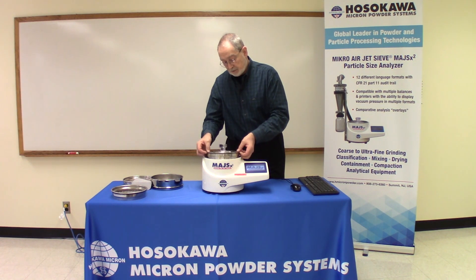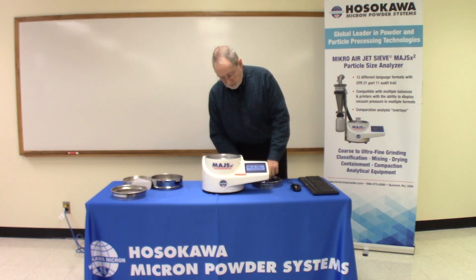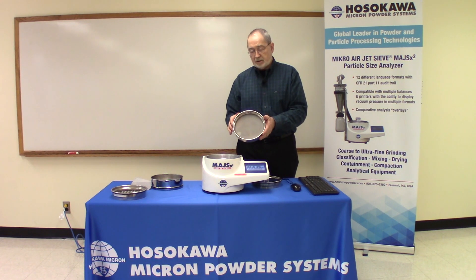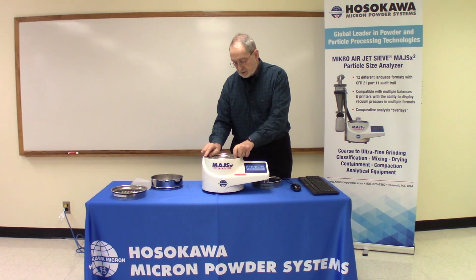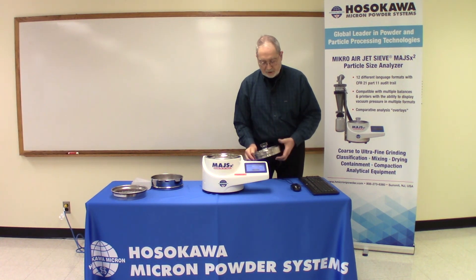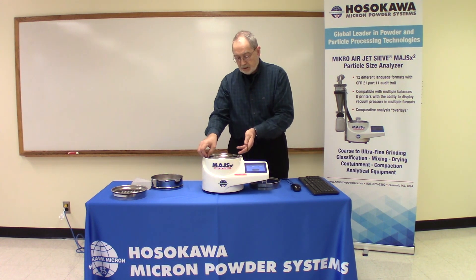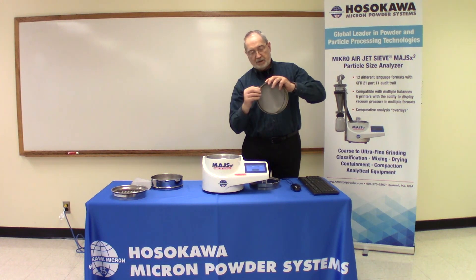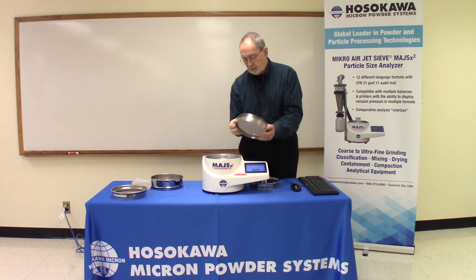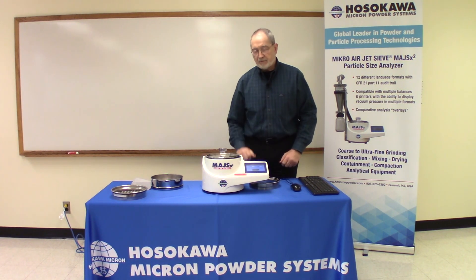Another unique feature of the Micro Air Jet Sieve is that we use 200 millimeter diameter sieve screens. This is our standard sieve screen, and you'll notice that it sits down low into the instrument. We strongly recommend — and we supply with each of the sieve screens — an O-ring. This O-ring seal gives you a more positive seal between the actual sieve screen frame and the housing. The sieve cover then fits down on top.